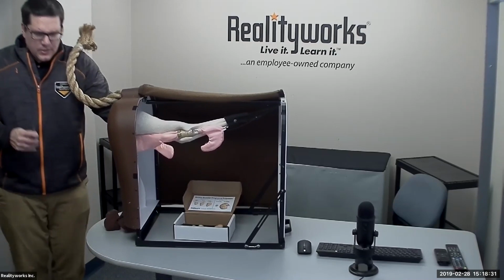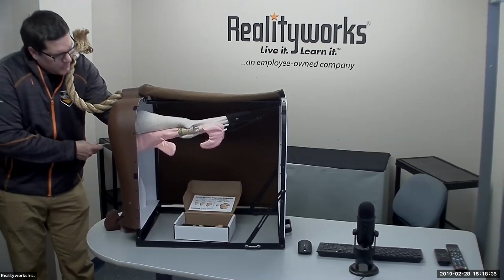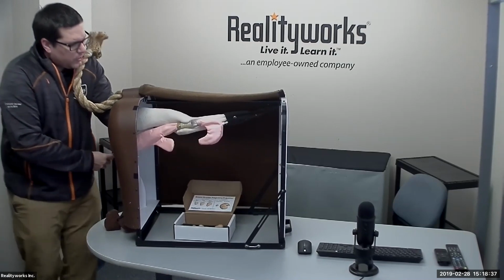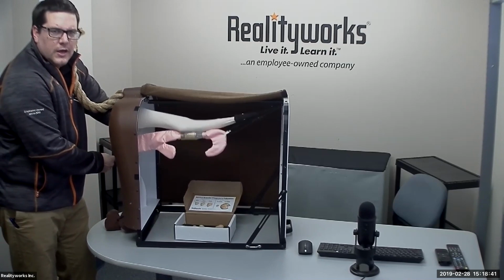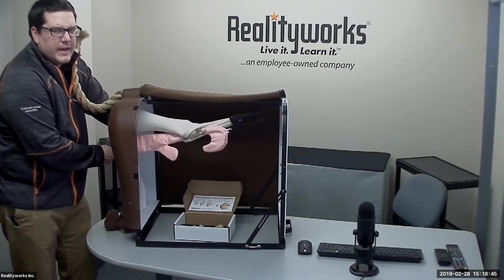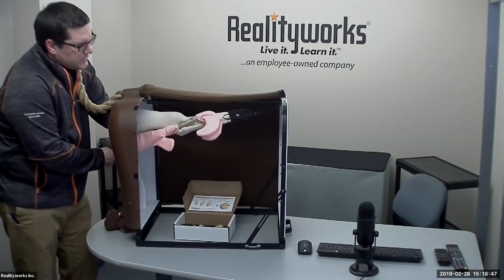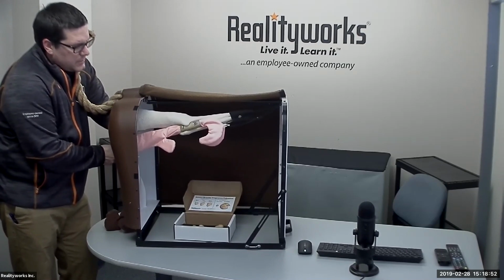So in this case, when I have my gun here, you're going to want to go into the vagina, go across the top, and again, I can feel where I am here. And then as I get a little bit closer, I can feel that I have hit the cervix. Now in this case, I have 3 different rings that I have to move and manipulate through.